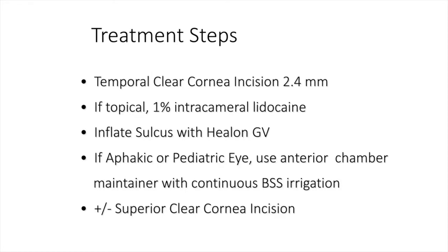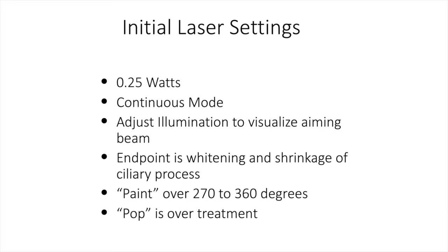From a treatment standpoint, I use a temporal clear corneal incision of around 2.4 millimeters. With a 2.2 millimeter incision, you might have a greater tendency for oar-locking, where the probe moves the globe from side to side as you try to reach a wider degree of ciliary processes. Inflate the sulcus with a cohesive viscoelastic — I tend to use Healon GV, which does a good job of elevating the iris off the ciliary processes. Initial laser settings: 0.25 watts on continuous mode. I adjust illumination to visualize the aiming beam. The endpoint is whitening and shrinkage of the ciliary processes, and I advocate for a painting motion over 270 to 360 degrees rather than treating one process at a time.